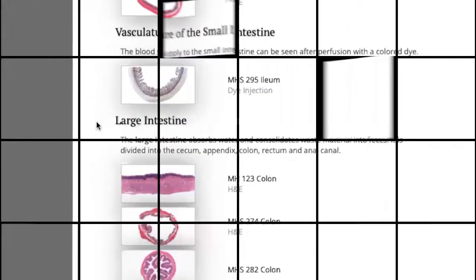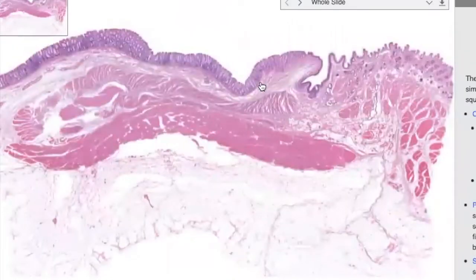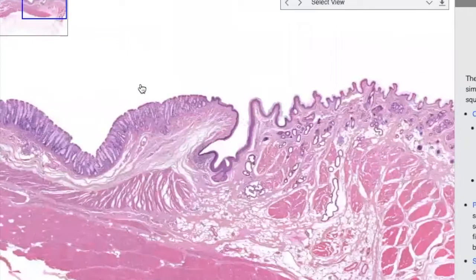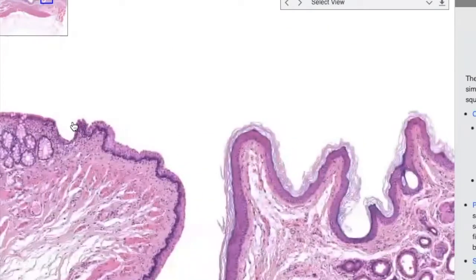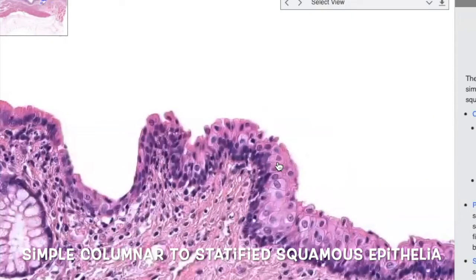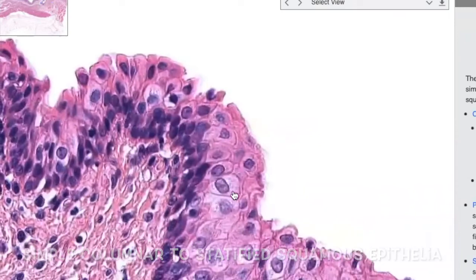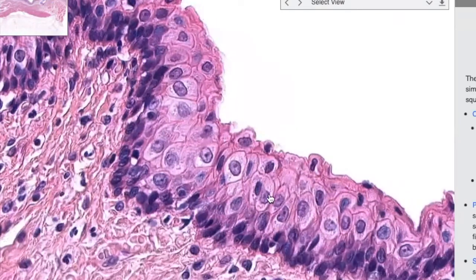And then, okay, we were moving through this last section. Now we're finally passing through. The feces has been moving through here. It's going to change from a simple columnar and start toward the anal canal, where you're going to transition into a stratified squamous. Right, this doesn't look like a lot of the stratified squamous that we've seen, but it is classified as squamous.